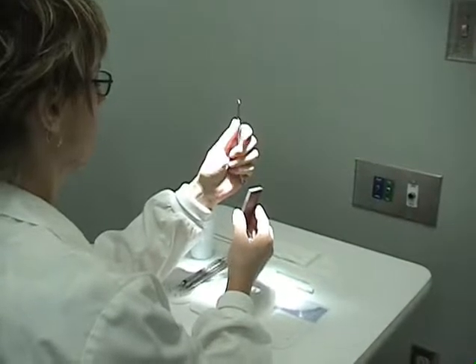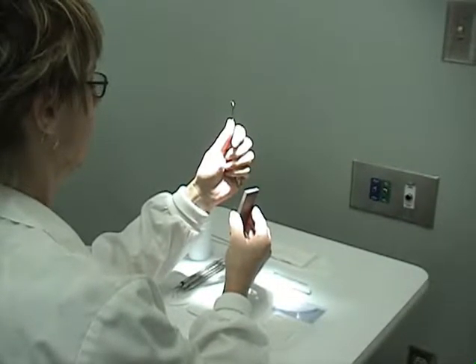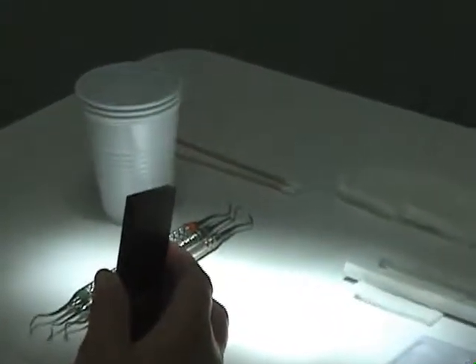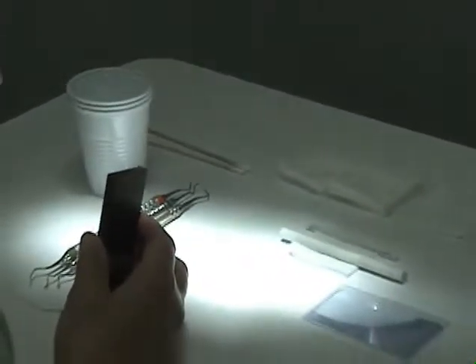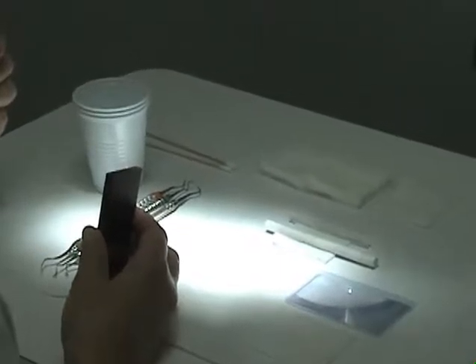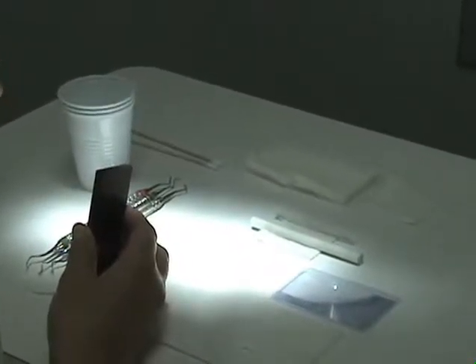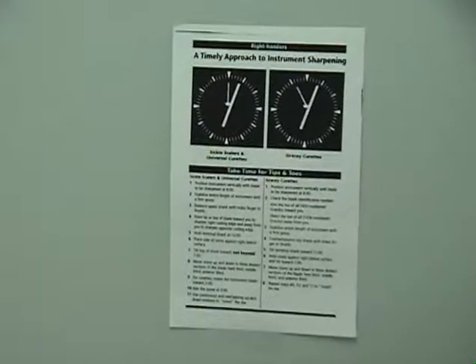The supplies and materials needed will be safety glasses, gloves if you are in your operatory while working on a patient, cotton tip applicator, gauze, magnifying glass, a plastic stick for testing for sharpness, your clock chart, a cup of water, two stones — one flat and one conical.